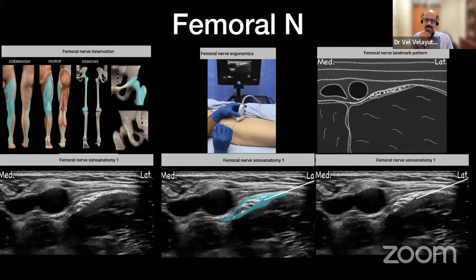Your local should surround your nerve above and below if you're lucky, but as long as it's on one side, it's okay. It's going to get numb. You don't need to be tempted to go all the way through. As long as it's somewhere in the vicinity of the nerve and not into the muscle, it'll work fine.